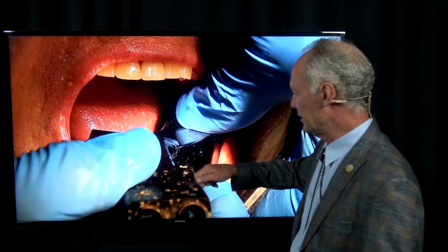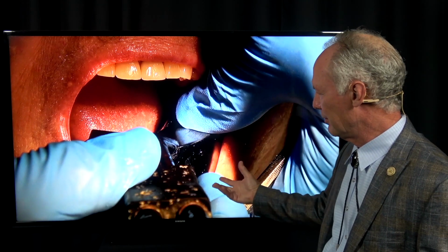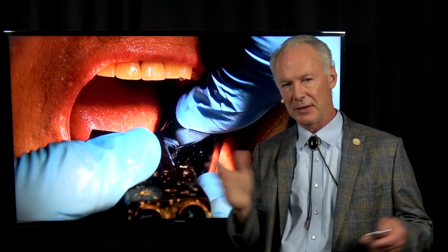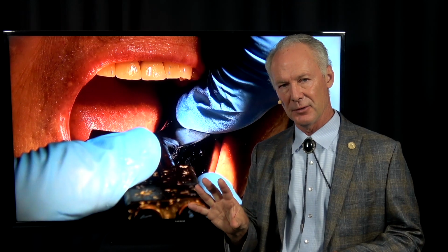You want to wet the tooth with warm water before you place the reversible hydrocolloid impression, because the cold makes the reversible hydrocolloid set up. You see these hoses running through channels in the tray, and that's water. It doesn't have to be ice cold water, just room temperature water running through those channels in the tray makes the reversible hydrocolloid set up.